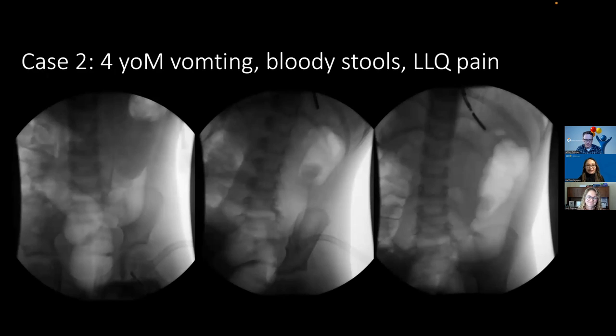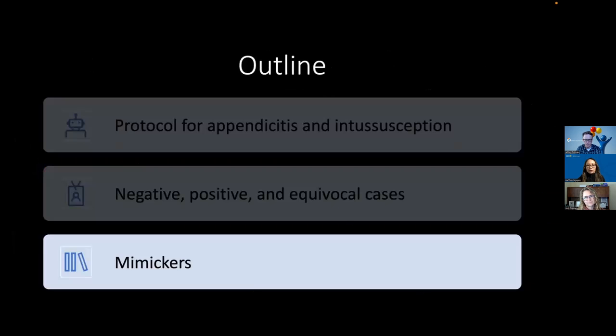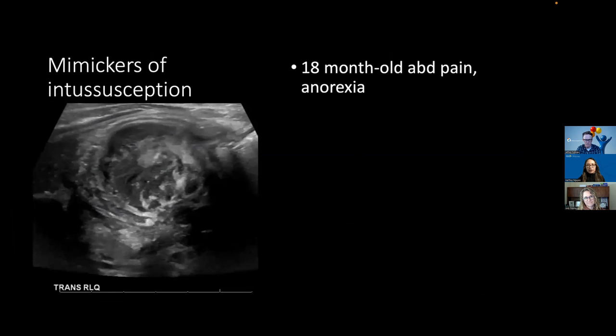Basically, I was the recipient of the ask from our surgeons to try to reduce this, and I was able to push that whole intussuscepted colon back a little bit. But of course, there's still a polyp there, which we knew, and eventually I think GI had to go in and snare it. The same reasons our surgeon gave: if you can reduce something, keep it from being edematous and from losing any blood supply, we would do that anyway. But ultimately they have to remove the underlying cause.